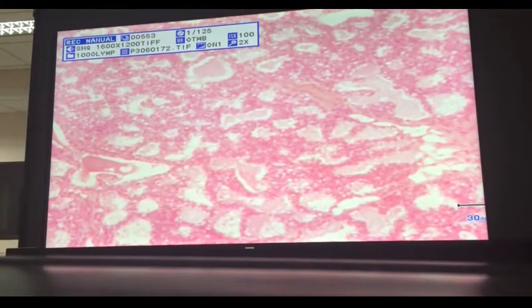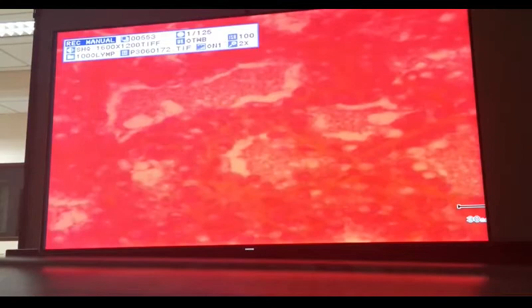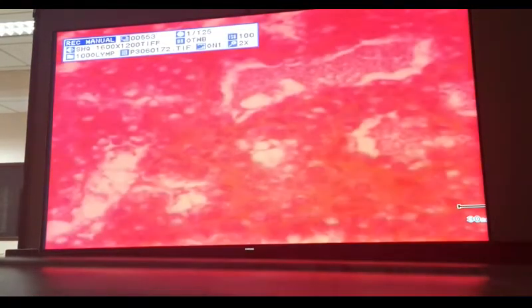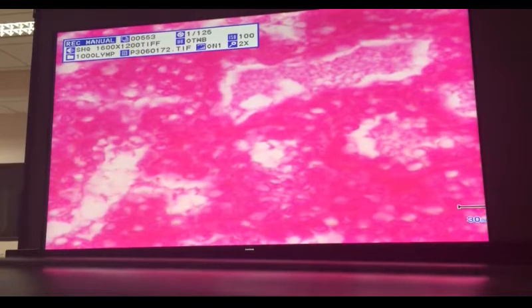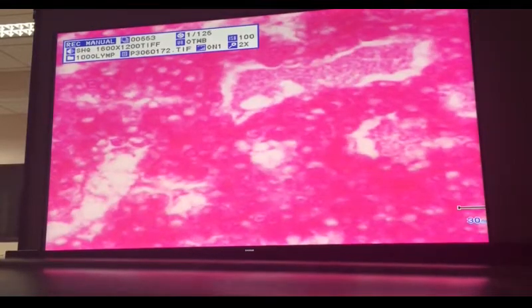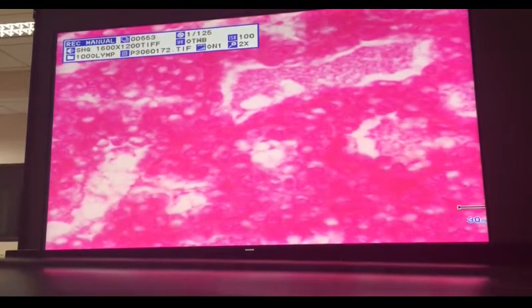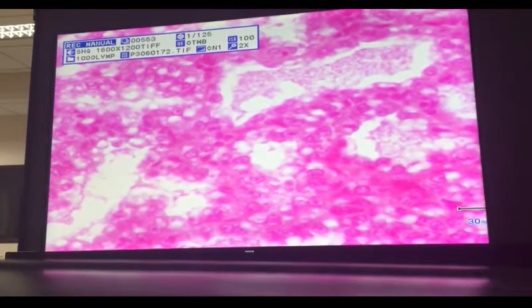So, the acini are larger than the usual, and then their lumen is dilated. That pointed material is actually milk. The pink, in the middle.